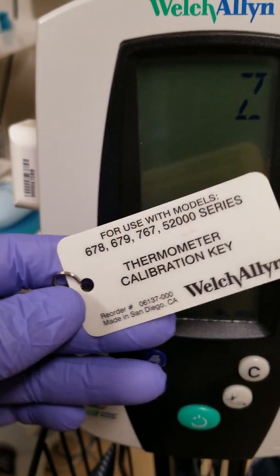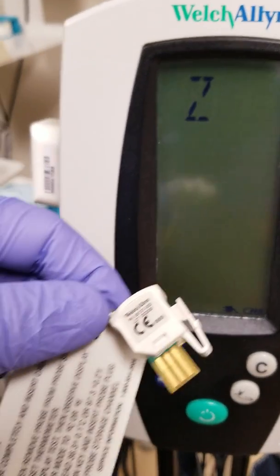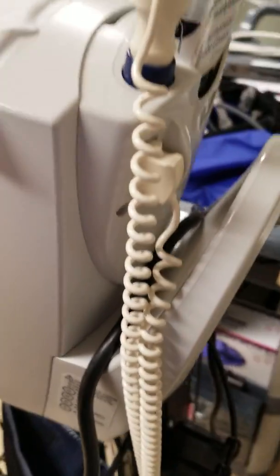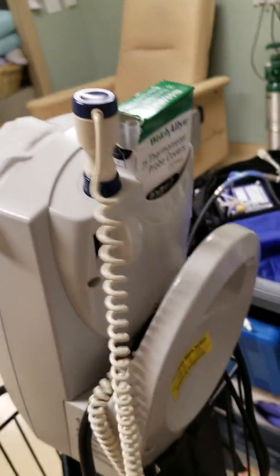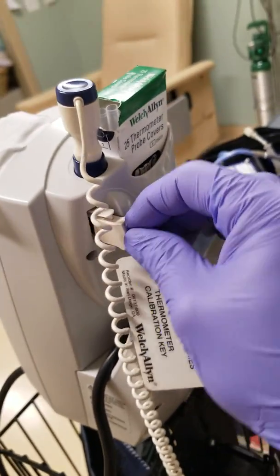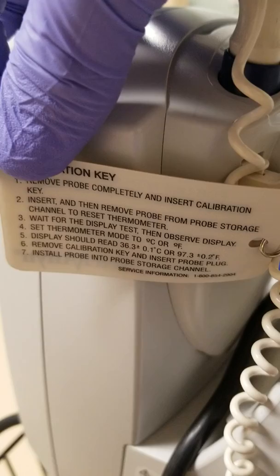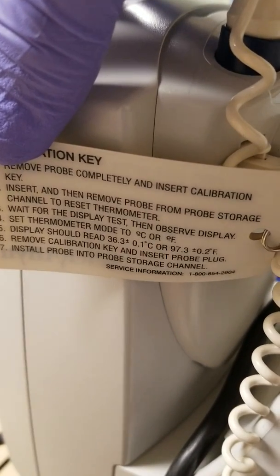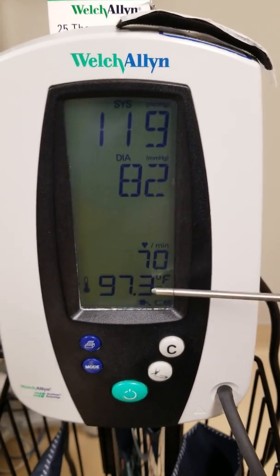Quick check on these: we have a thermometer calibration key. This is the older style. Go ahead and unplug the thermometer here and plug in the calibration key. My number is 97.3°F, which should display — so number 97.3 or 36.3°C. Here we measure and confirm the reading — our indicator shows 97.3.